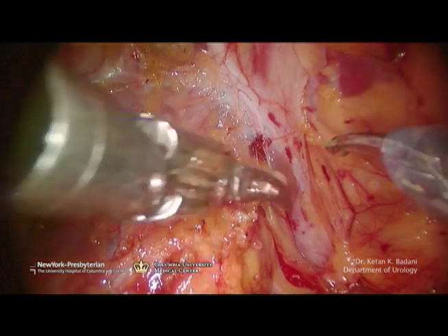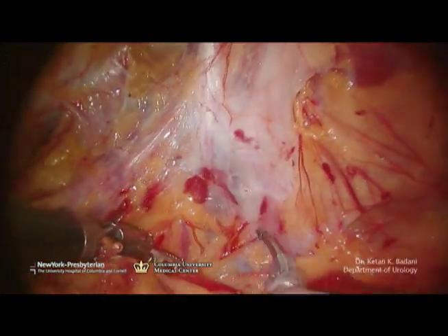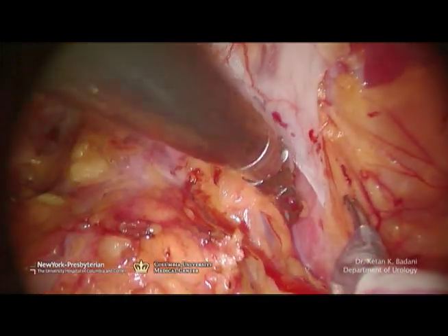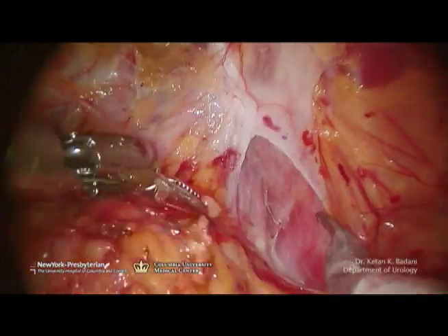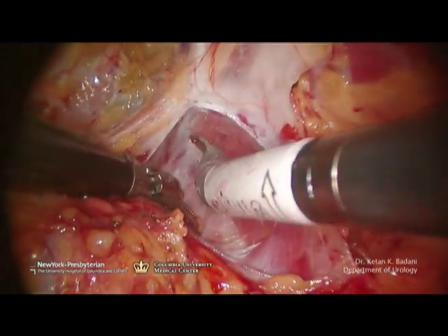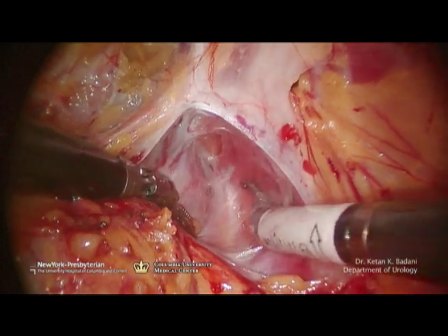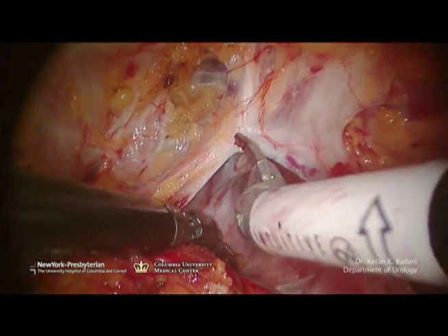Now I put tension on the prostate, pull it medially, and gently incise in the space between the levator muscles and the prostate. The space behind the endopelvic fascia is very easily and bluntly separated. No cautery is used at this point. The neurovascular bundles are near, and this is an avascular plane without any large vessels that would require cautery.